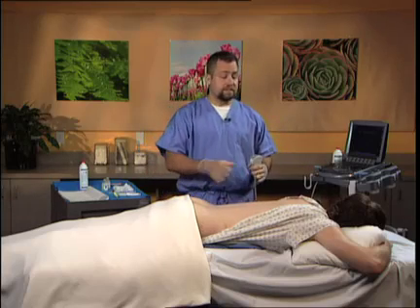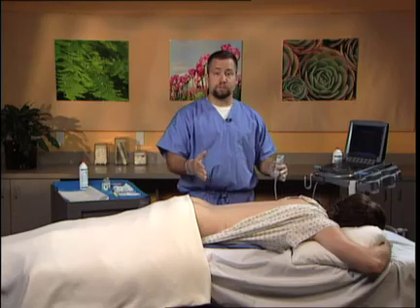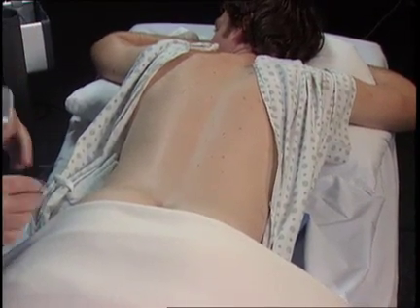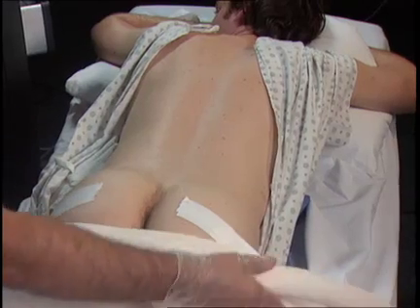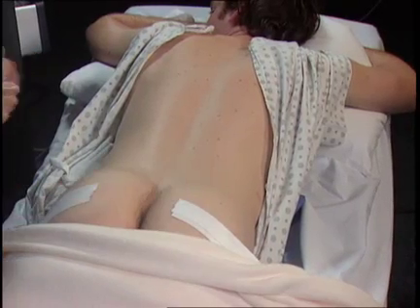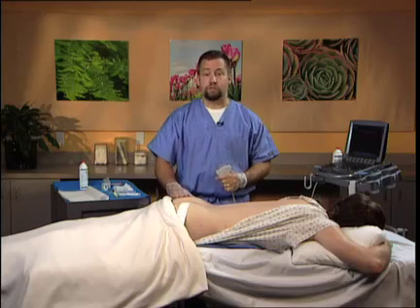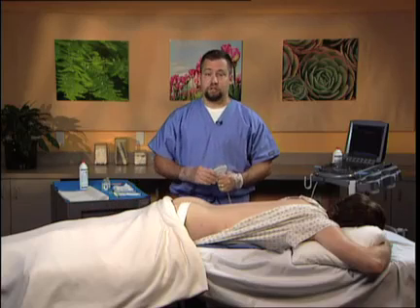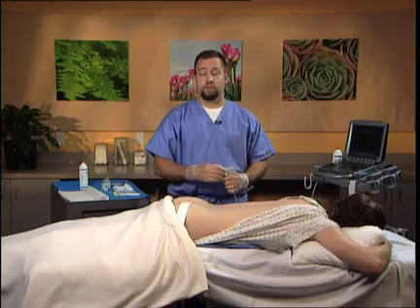In order to facilitate placement of the patient for the procedure, it is necessary to have the patient in the prone position as seen here. This is a typical position that would normally be used for a lumbar epidural steroid approach. One key difference, however, is the need to move the gluteal folds so that access to the sacral hiatus — which is the key target — is facilitated. You can see that the gluteal folds have been taped down and away in a caudal fashion to the patient, providing a clean access point within the two gluteal folds.